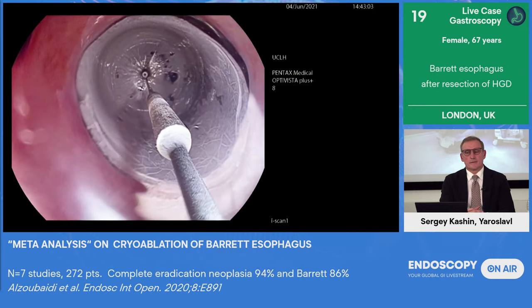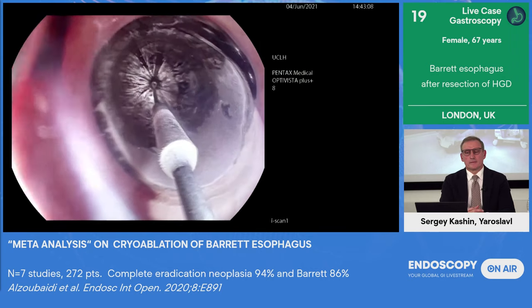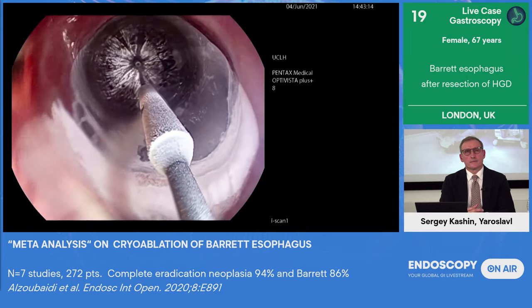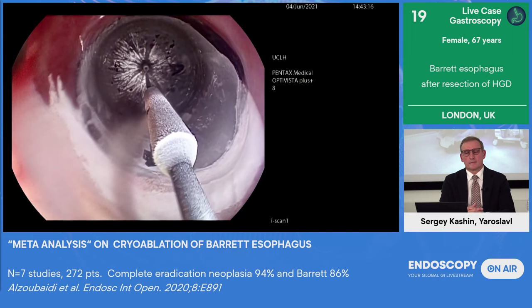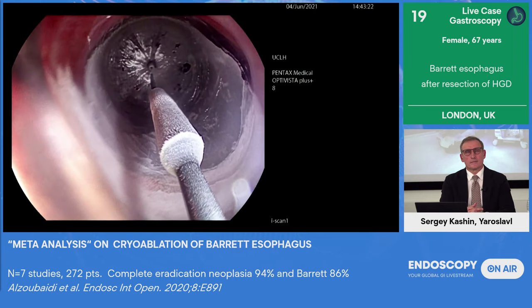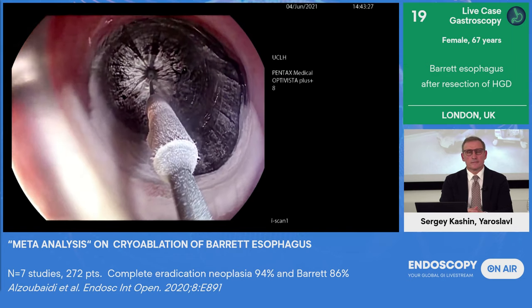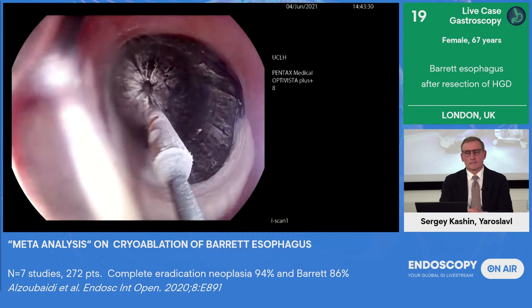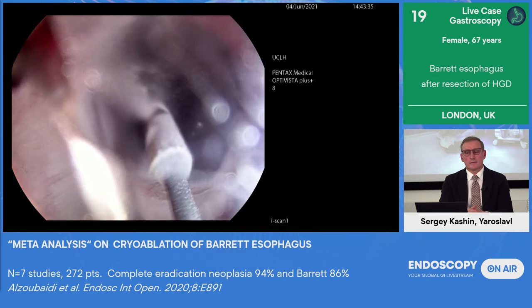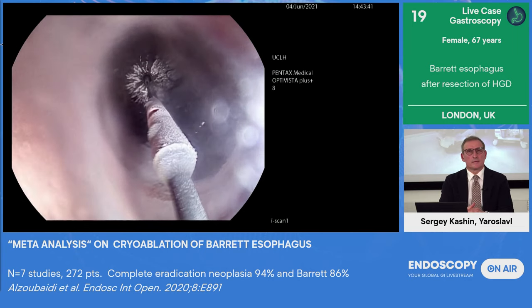And I'm comfortable here because I know that I don't need to be 100% accurate in terms of where the balloon is, because I've got a lot of maneuverability here in terms of where my ablations are going to go. So I'm very carefully using my left hand and my left shoulder just to help maneuver the endoscope to the area that I want to go. And because you have a narrow caliber esophagus here, one of the benefits is that the spray really does spread quite nicely. So you don't need to be too aggressive, and with just three ablations here, I've got this nice sort of Christmassy feel to my esophagus, where we've almost completely ablated the entire area.